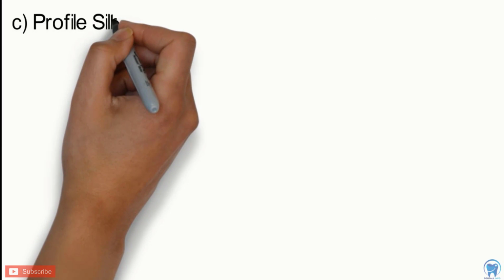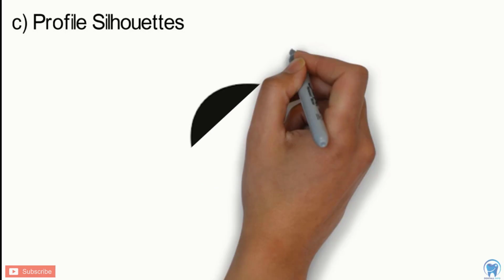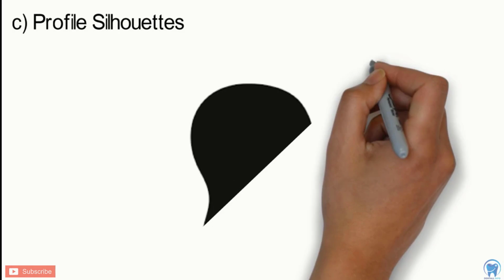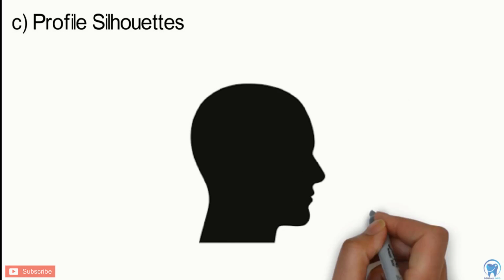Also, profile silhouettes can be used. Lead wire adaptation along the midline helps preparing a cardboard cutout which is preserved after extraction of teeth. It is then positioned on the face after the vertical dimension has been established and or when the artificial teeth are tried in.